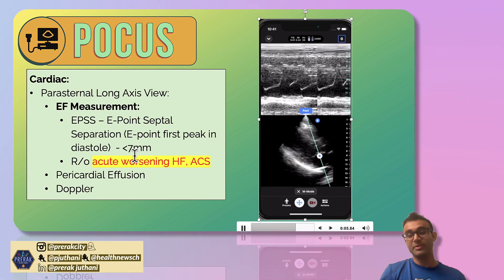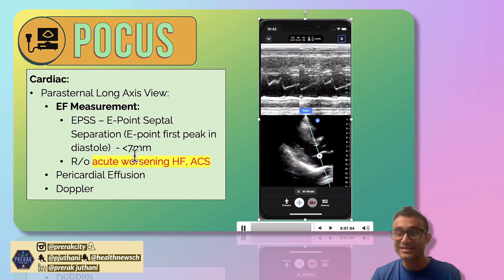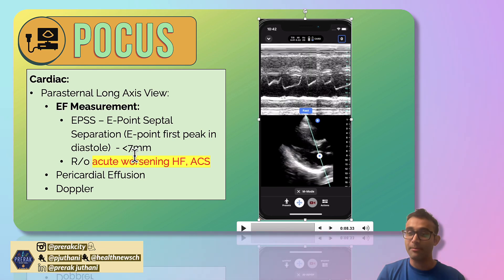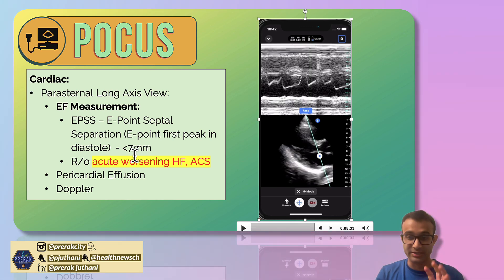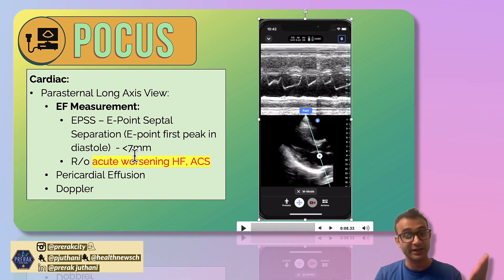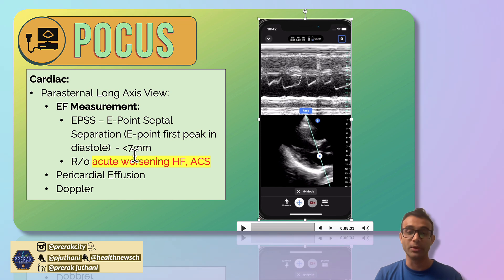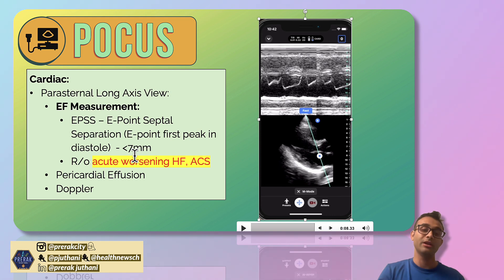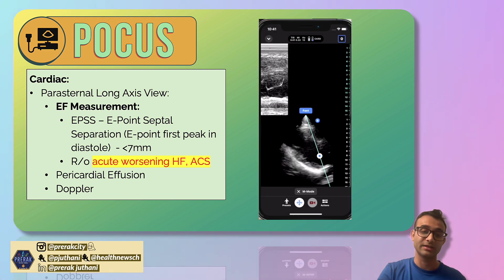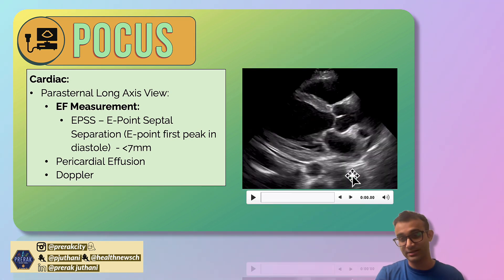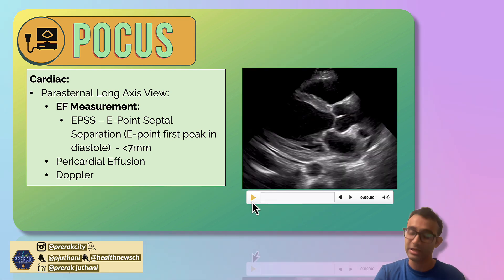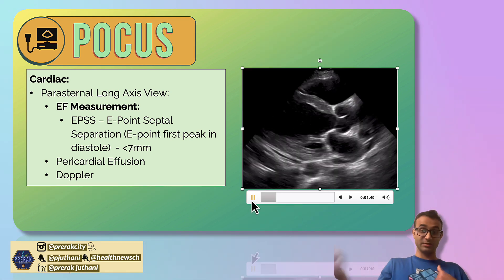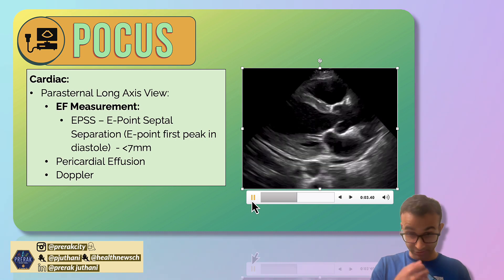Just by looking at this view, you don't even need to turn on M-mode — you can grossly assess it visually. If you can see the mitral valve hitting the septum, you can essentially rule out worsening or acute heart failure as a cause of someone's hypotension. But if you see a valve that's not moving toward the septum, you can't rule it out and you can say this person has decreased ejection fraction.